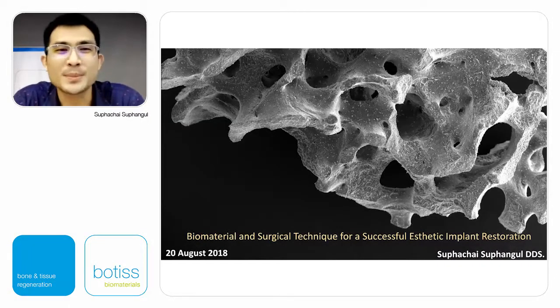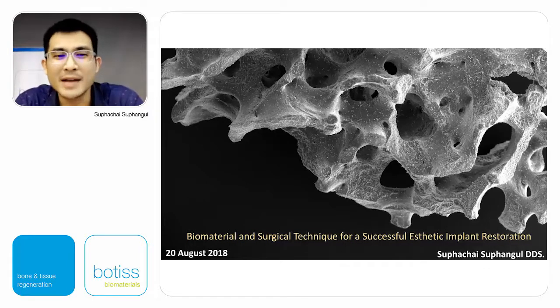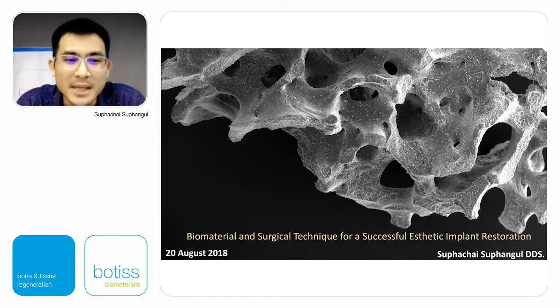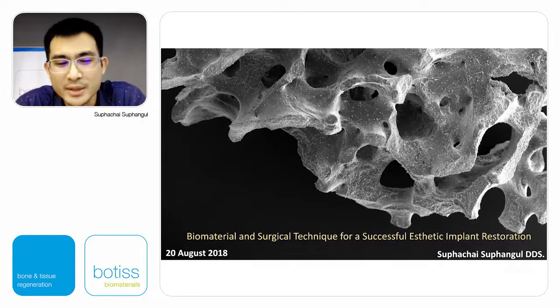I'm Dr. Suphachai Suphangul. Right now, I would like to share my experience on the topic of biomaterial and surgical technique for successful aesthetic implant restoration. As we know, implant dentistry is very popular nowadays.